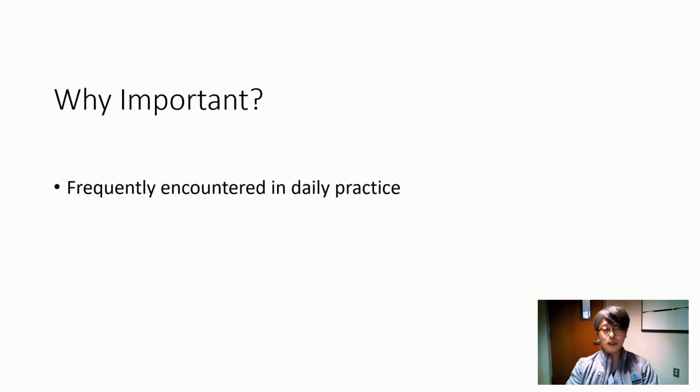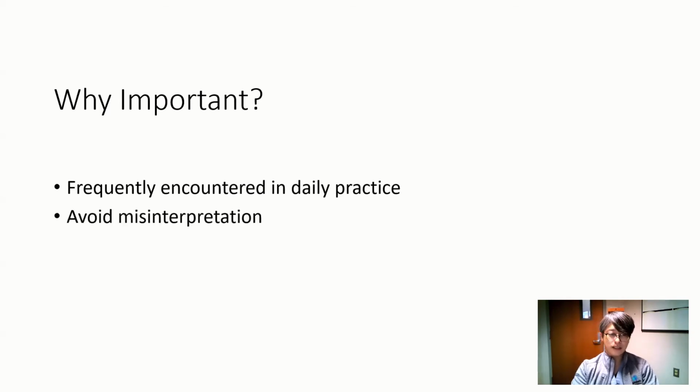And why is it important? Because we frequently encounter artifacts in daily practice, and it is sometimes confusing when we see one: is that a true image or just an artifact? So we need to avoid misinterpretation.